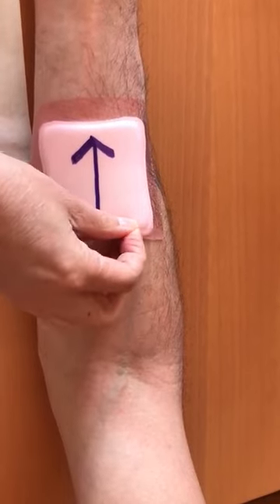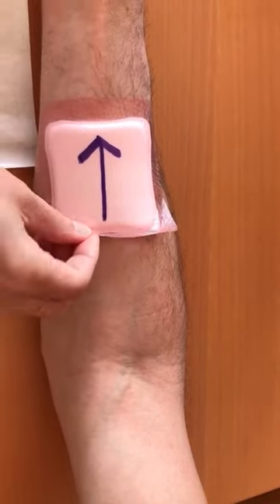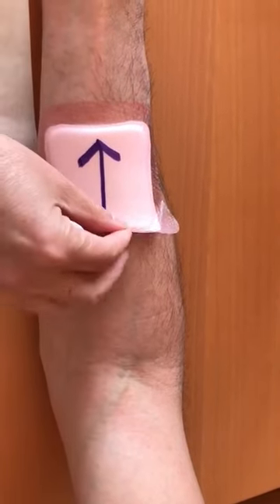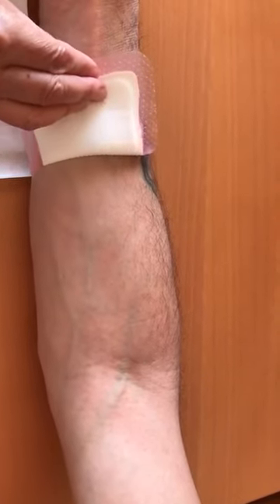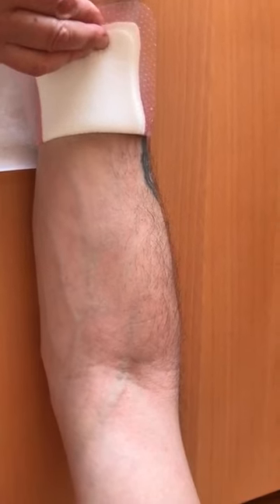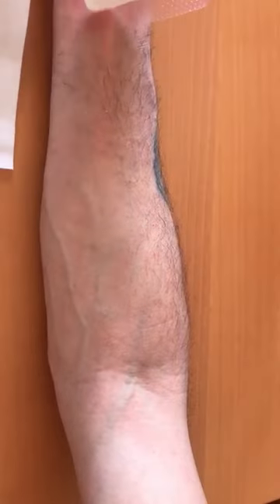Take time to remove the dressing slowly. Remove the dressing in the direction of the arrow to protect the skin flap. Monitor for any changes to the wound and exudate levels. Determine the date of the next wound review and dressing change and document all assessments. Use an emollient to soften and smooth wider skin area and prevent further tears.